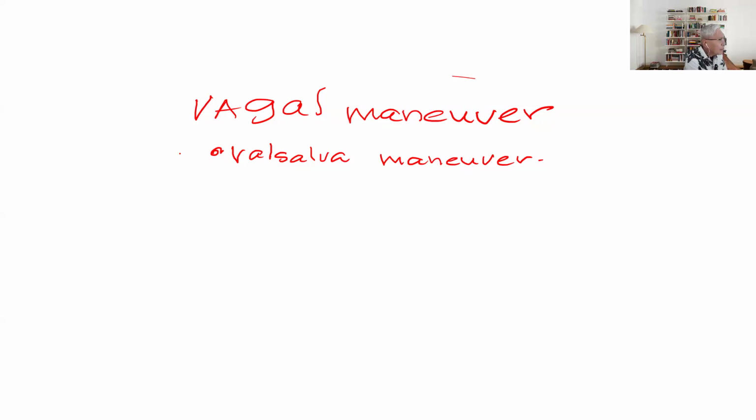Now, another thing is that just merely holding your breath is going to be a form of Valsalva maneuver. So when you are underwater, do you breathe? No. Or if you hold your breath, what's going to happen? You're going to slow down the heart rate. So you can do this experiment when you are in the clinical area and you have, let's say, an electrocardiogram. Connect yourself, and hold your breath. You will see that your heart rate is going to gradually decrease.